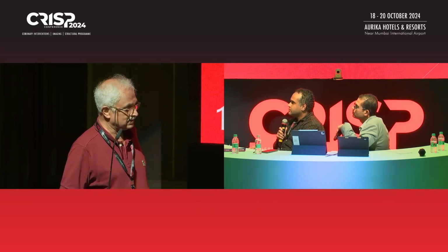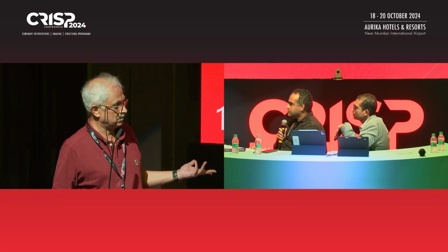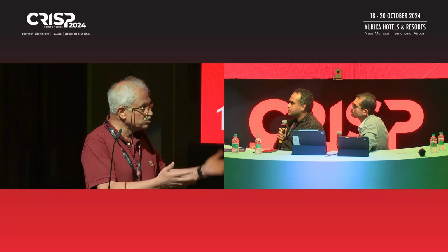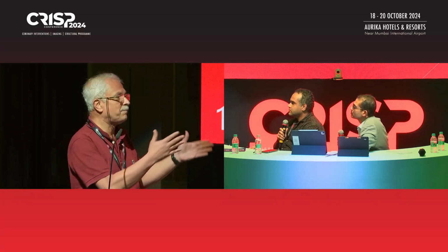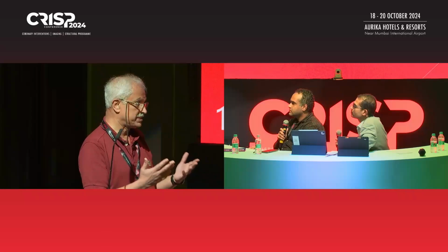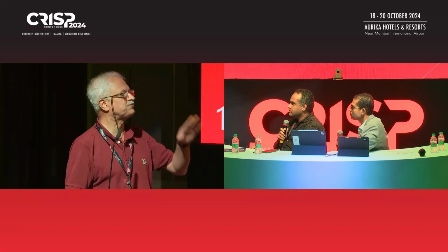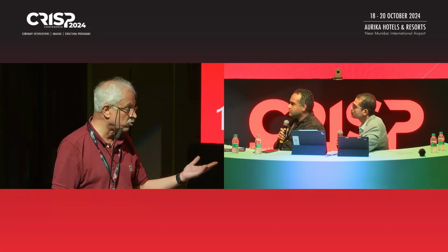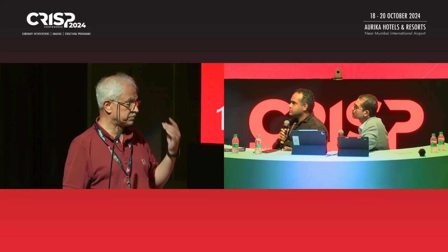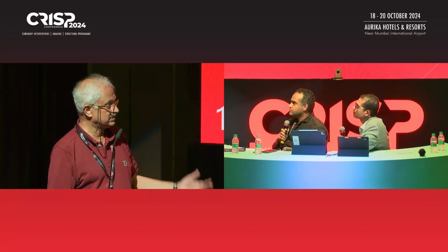ultimately why do you size? Everything is an approximation. Whether you do a 2 millimeter addition, 4 millimeter addition, 6 millimeter, it's all an approximation. And even balloon sizing is an approximation. But in our experience, balloon sizing is the best of the approximations, because the number of ASD devices I had to change after I came back to balloon sizing is far less as compared to what we would when just looking at the TE and deciding that we will add 2 millimeter, 4 millimeter, aortic rim is absent, so let's do 6 millimeter. That's an approximation as well.